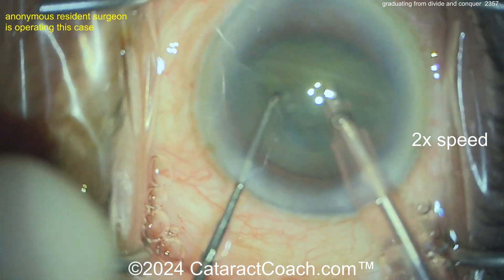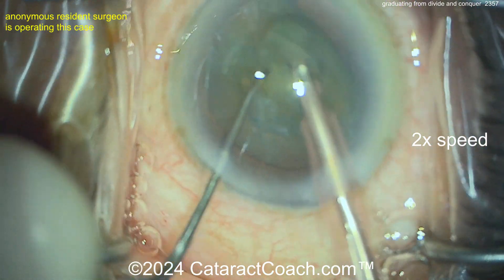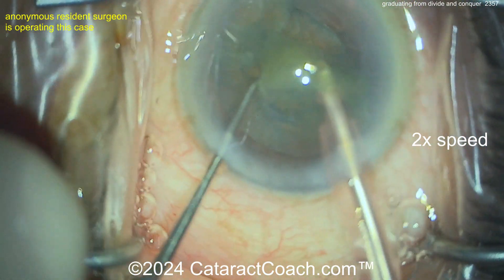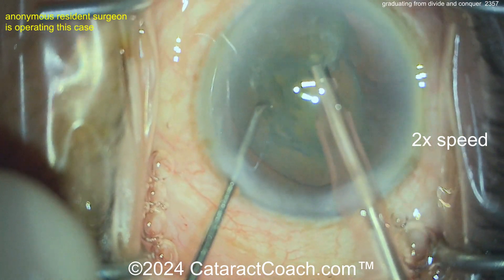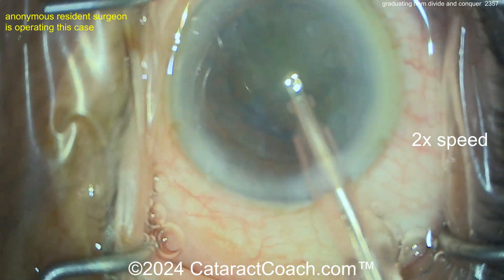Divide and conquer is a fine technique and you could certainly do it for the entirety of your career, but I encourage you to expand your knowledge base. Learn to do stop-and-chop — it's an easy progression from this — and then from there, learn to do faco chop. Hey, you did a chop — you know what you're doing, good job.